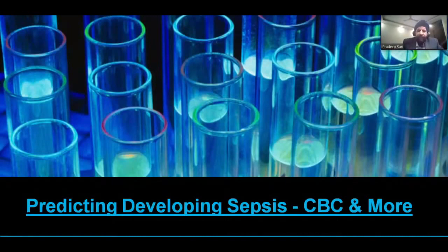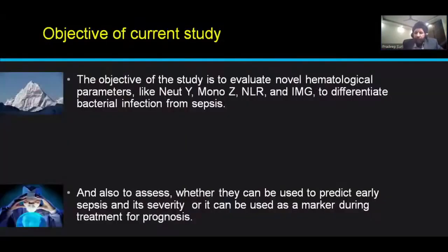What we were trying to do was evaluate all these novel WBC parameters, NEUT-Y, MONO-Z, neutrophil lymphocyte ratio, and immature granulocytes, to see whether they can differentiate, A, bacteremia from septicemia, and B, whether they can be used as a prognostic marker to predict severity of sepsis. Or they could be used just like procalcitonin, where as the procal values reduce, they wean the patient off the antibiotics. Can some numerical values be used as a surrogate marker to procal in this study?